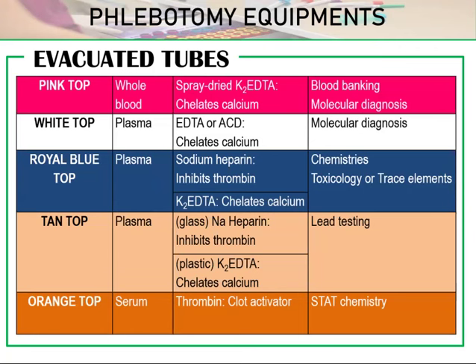And if green top is our top 1 for stat requests, our top 2 is the orange top. Instead of the 15 to 20 minutes waiting time, it is much shorter with the orange top. Just 5 to 10 minutes of standby, or the optimum clotting time before centrifugation. Okay?